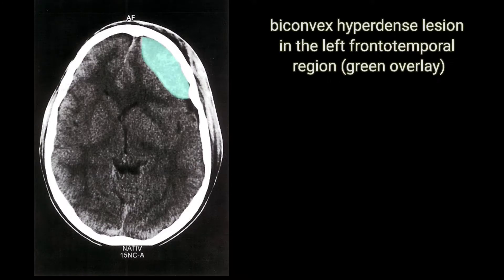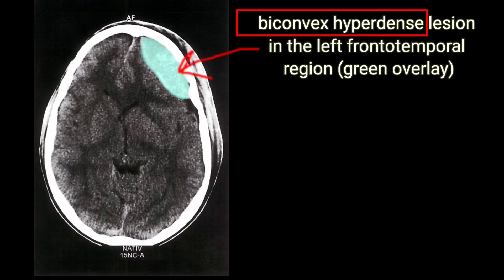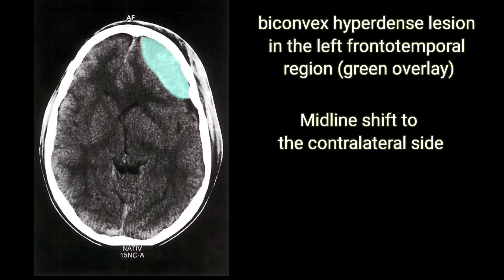In this image, we can see a biconvex hyperdense lesion in the left frontotemporal region, as we can see in the green overlay. We also see the brain hemisphere is shifted to the midline, to the contralateral side of the hemorrhage.